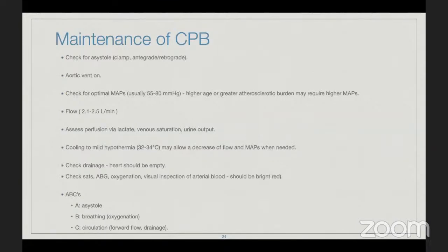Beautiful, perfect. So what she meant, I think, is that 2.1 to 2.5 is the cardiac index. Normally it's 2.4 that lots of people use, but some people find with 2.4 the field is flooded a little bit, and they go a little bit down to like 2.1 or something like that. But again, this is the number, 2.1 to 2.5 cardiac index. But the unit is different, it's not going to be like this.